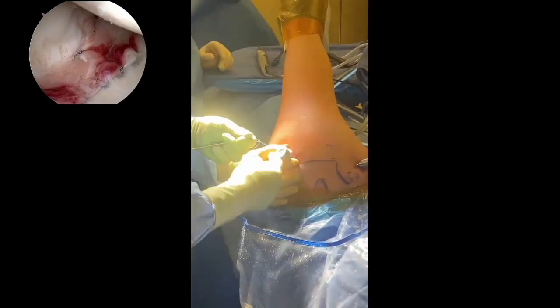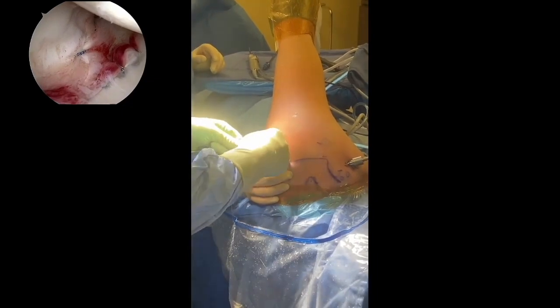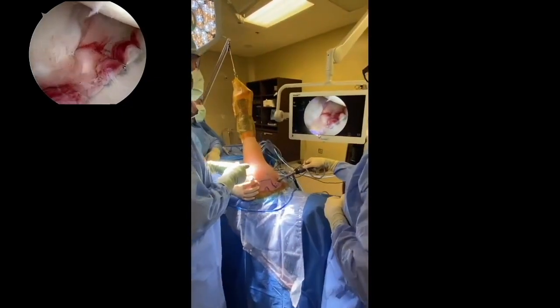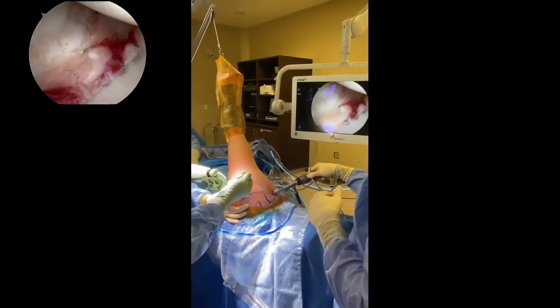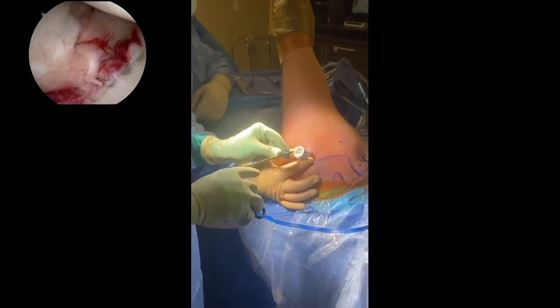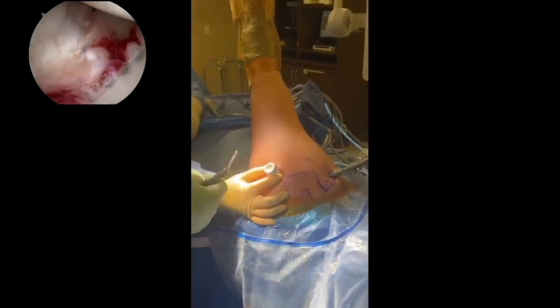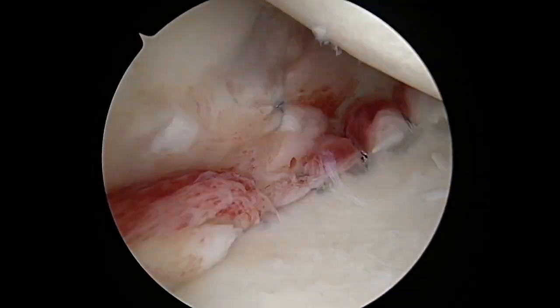We're going to tie a sliding locking knot. This is a Weston knot. We're going to tie this knot blind. We'll push the knot down. One assistant holds the cannula, push the knot down and flip it, and then place subsequent half hitches to secure the knot. This suture cutter slides down to the knot and allows you to cut blind, leaving a 2 to 3 millimeter tag. And this is the completed capsulolabral repair with posterior portal.